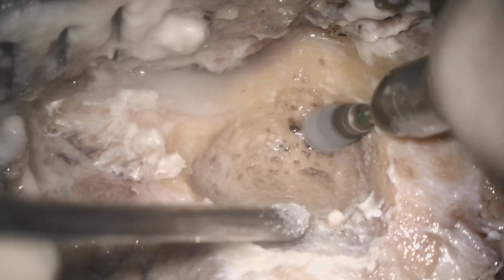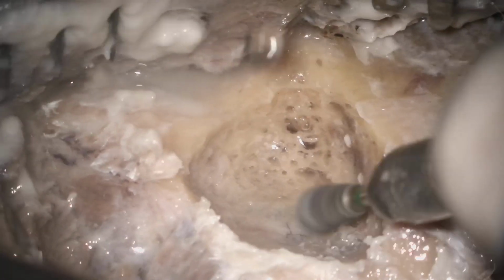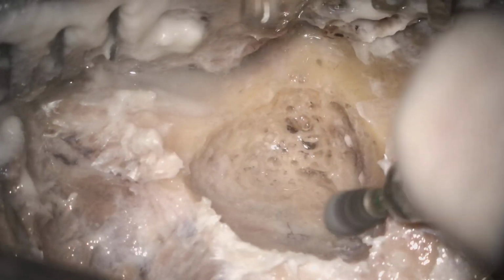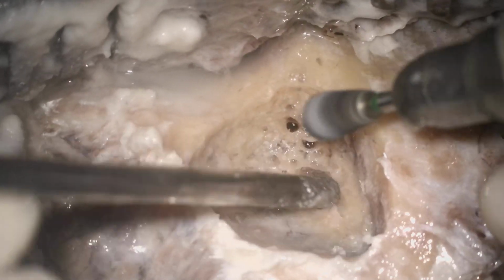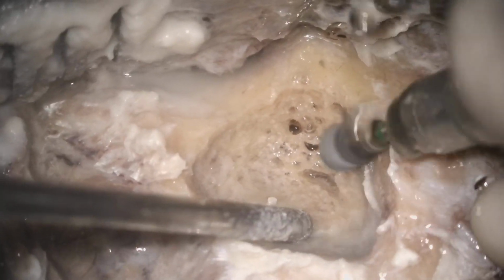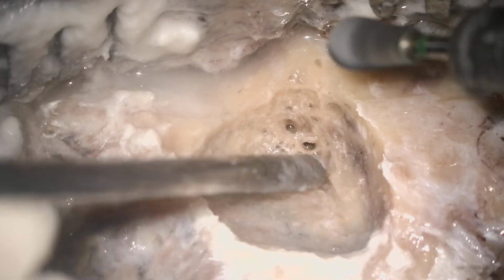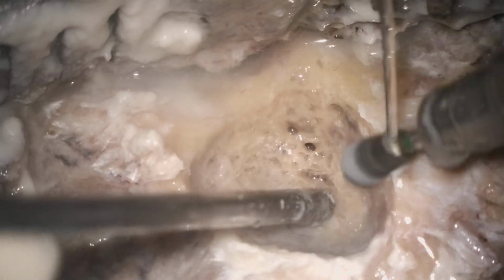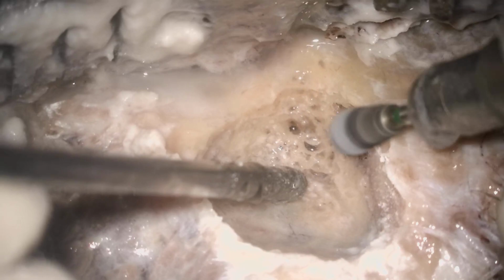So this is where we are getting the tegmen. I am going by dissecting the important landmarks. We have already identified the sigmoid sinus. This is the sinodural angle that is coming. So this will be the tegmen. So this is the tegmen. Okay, you can visualize some blood vessels over there.